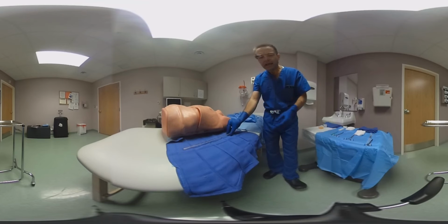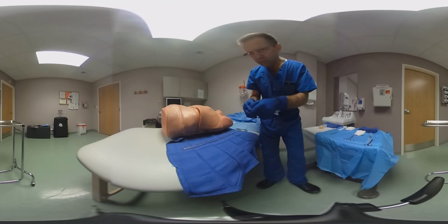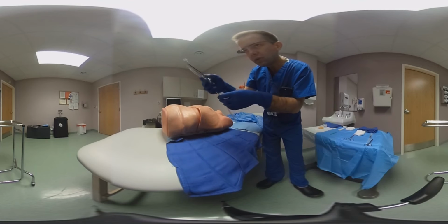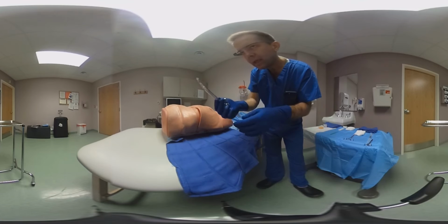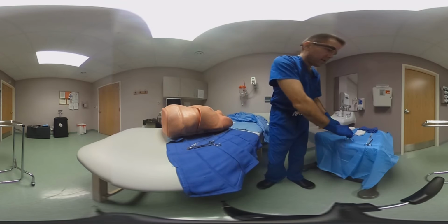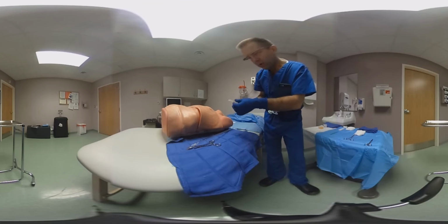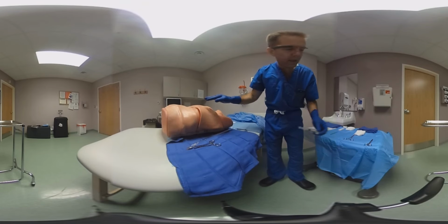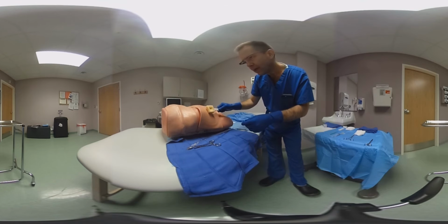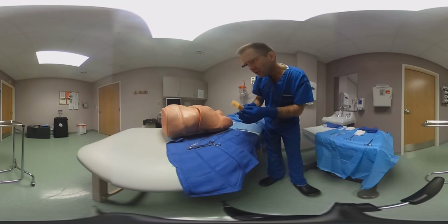In any case, we set up the tube by connecting a Kelly type curved clamp on the tube to help us direct the tube when we are going into the patient's pleural cavity, and we inject a local anesthetic after having prepped the area with a solution. I'm going to obviate that to sterilize the area. This is a sterile procedure.